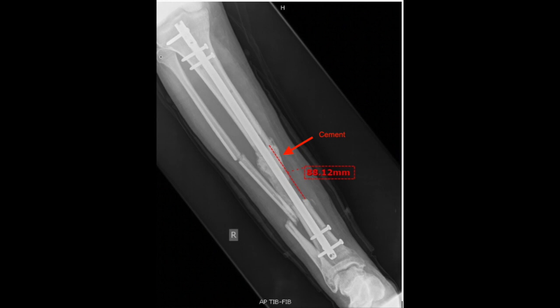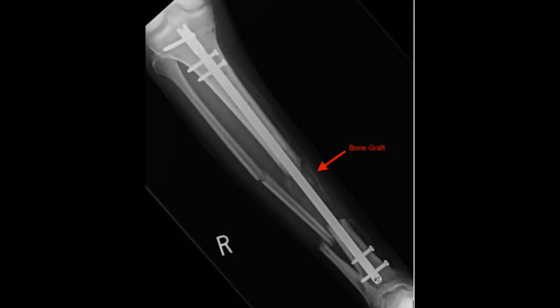The patient's anterior compartment musculature was found to be compromised, with significant damage to the tibialis anterior muscle; however, the tendons were intact. Two months later, the patient was taken to the OR for the third time to perform the second stage of the Masquelet technique. The cement spacer was removed and the defect was filled with bone graft harvested from the right femur. The Achilles tendon was also lengthened as the patient had developed an equinus contracture.